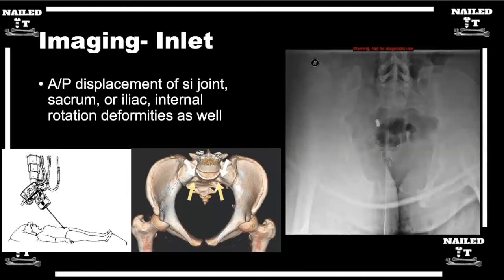The other thing this can show you — although the inlet in particular is the image that lies the most — is because the inlet view you need to look at certain sacral segments is different, because everyone's sacrum is shaped differently. Each level has its own amount of kyphosis or lordosis, and the SI joints themselves are undulating in nature. So you never get a perfectly clear look down an SI joint that's through and through, but you can look at some level of the anterior and posterior translation of an inter-terminal pelvis.